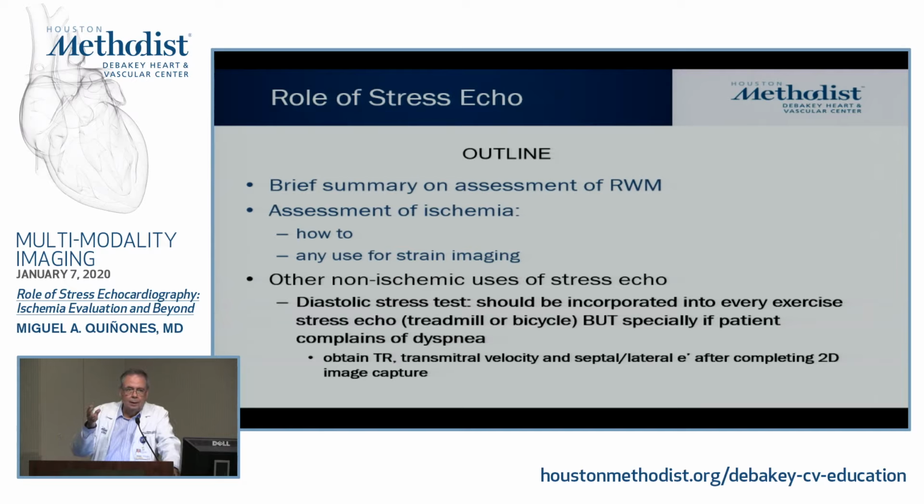In fact, there is some experimental data suggesting that the stunning of diastole may last longer than systole. So if it took you 90 seconds to get your imaging, you still may have enough stunning that you can pick up that elevation of filling pressures and PA pressures.